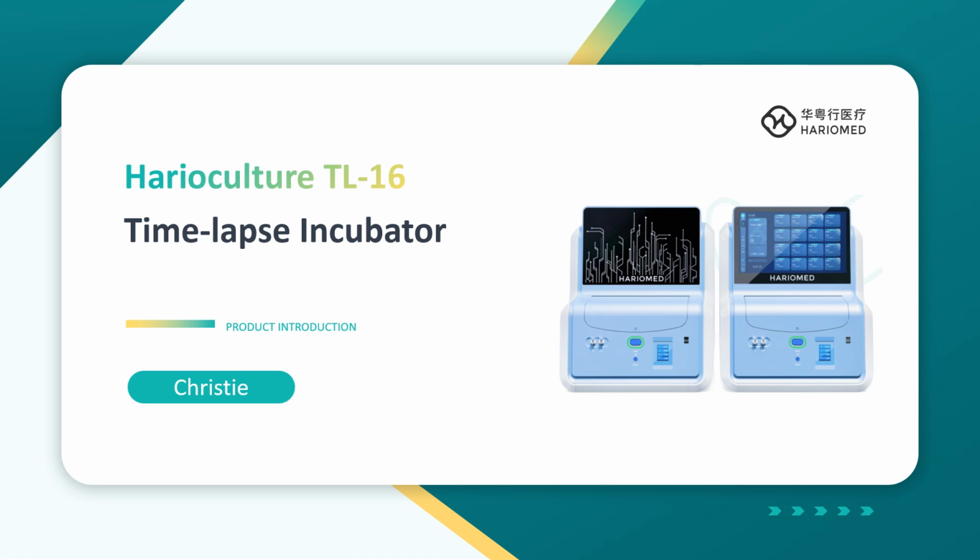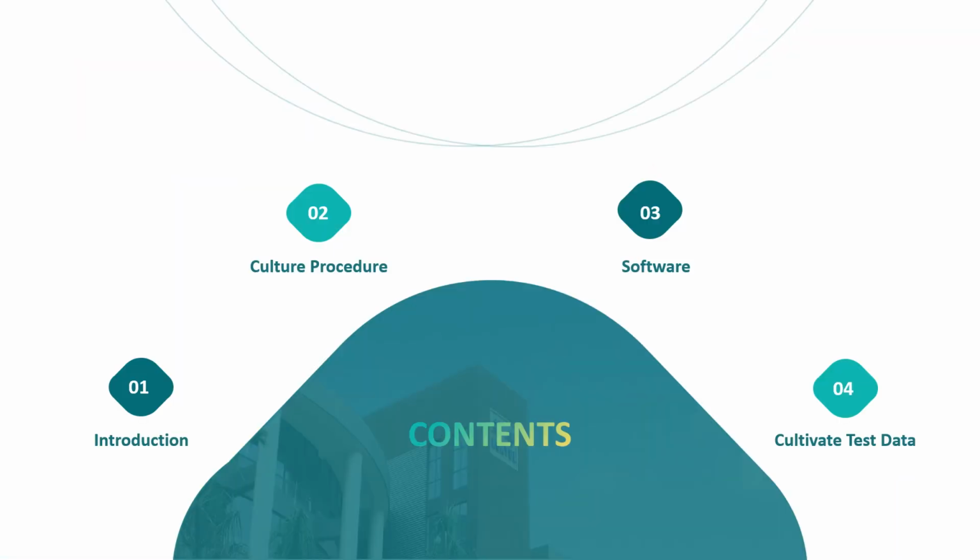Hello everyone. So today I will give an introduction about our Hariomed Culture Time-Lapse Incubator. Today's introduction will be in 4 parts: introduction, culture procedure, software, and cultivate test data.